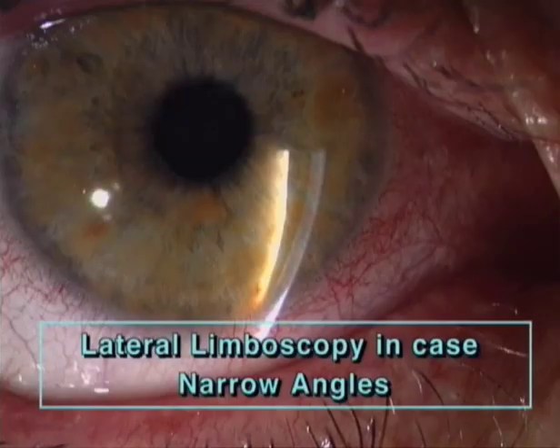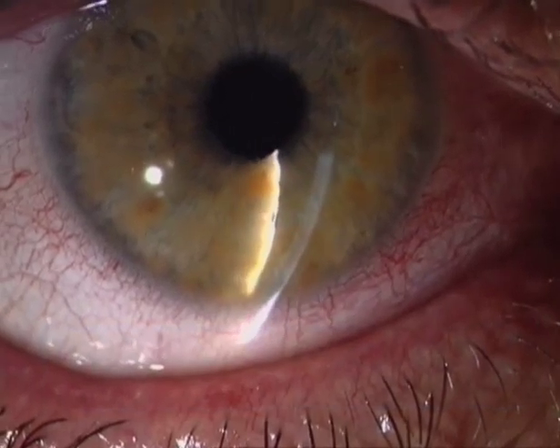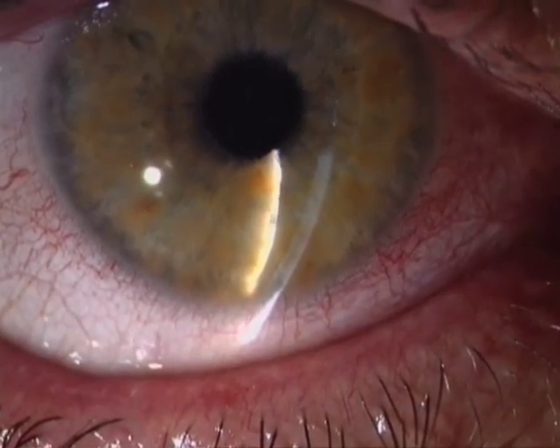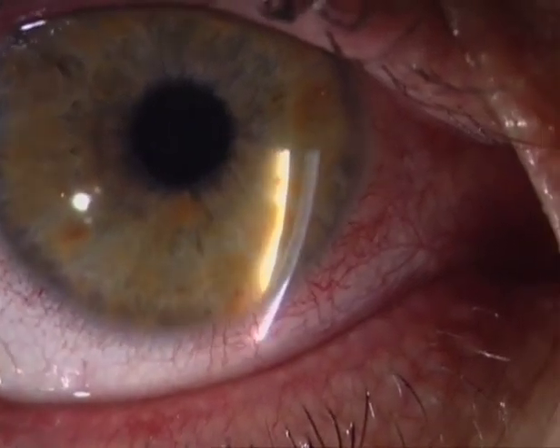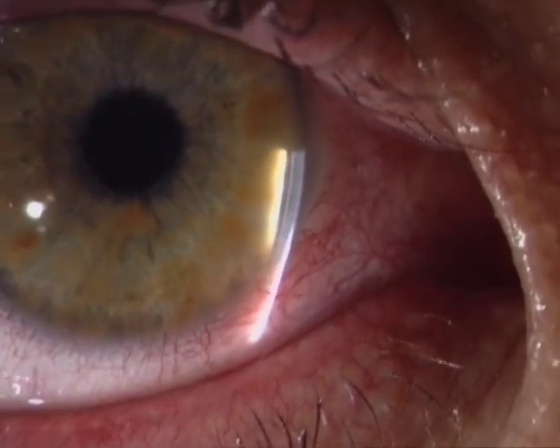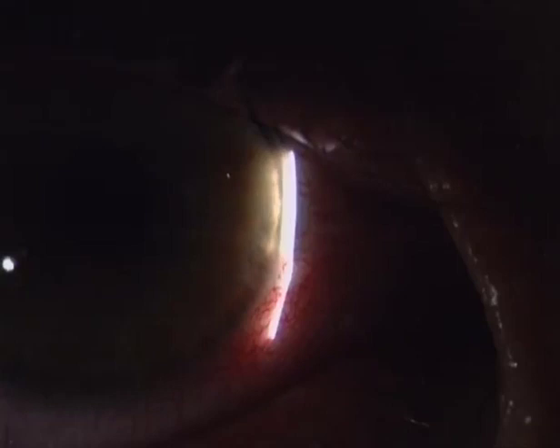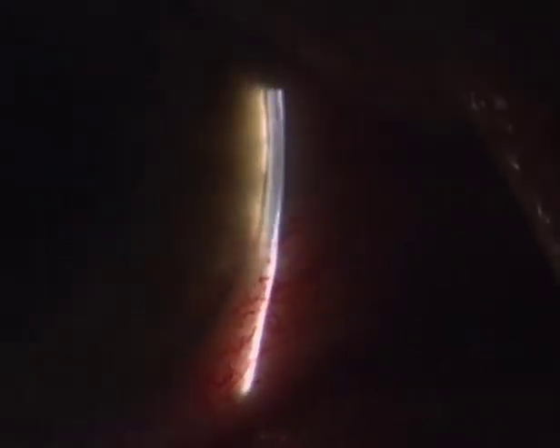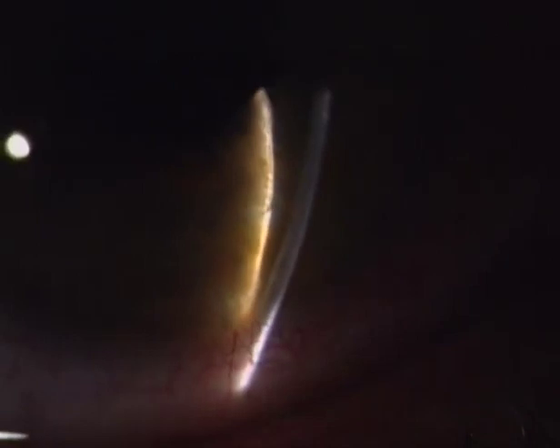Problems with lateral limboscopy. Here we examine a narrow angle in lateral limboscopy. In the center, the anterior chamber is moderately deep. But when we approach the lateral limbus with the light slit, the angle appears nearly obliterated. When we compare the width of the chamber laterally and at the lower circumference, we note that it appears deeper in its lower parts than laterally.